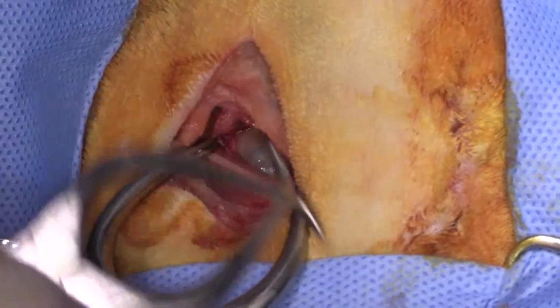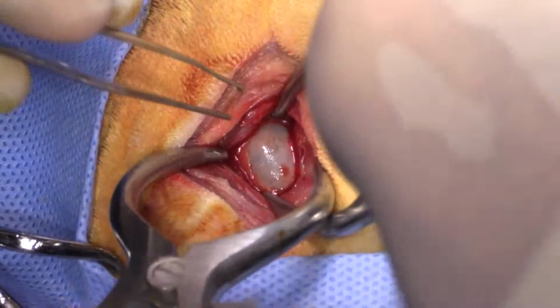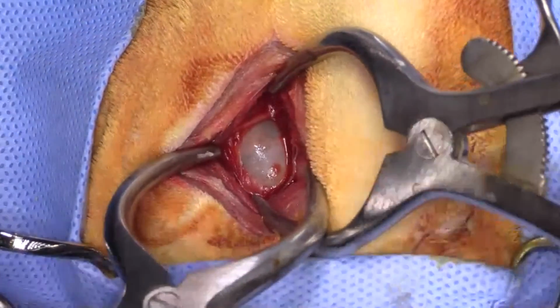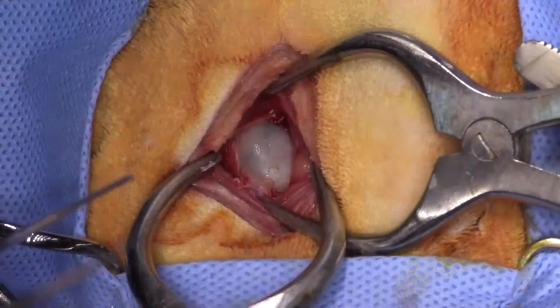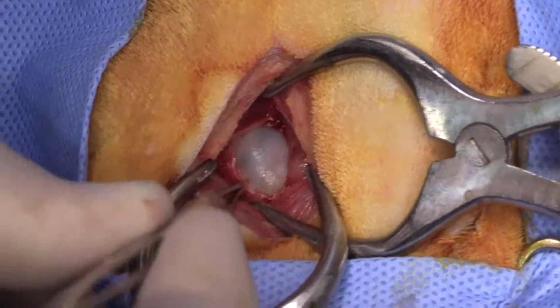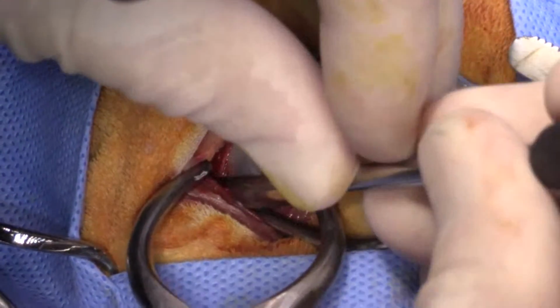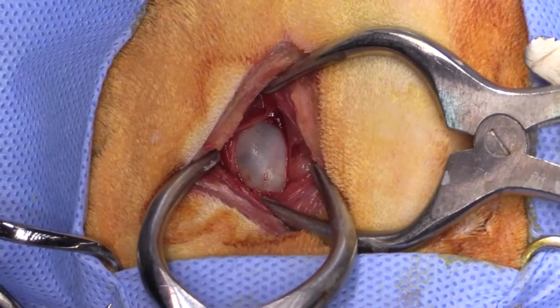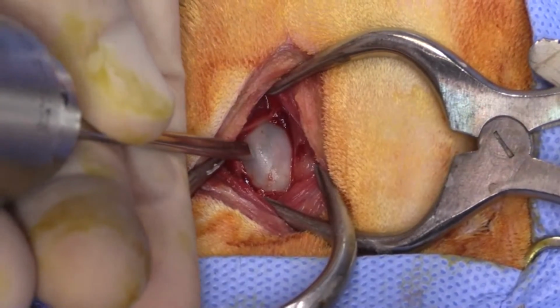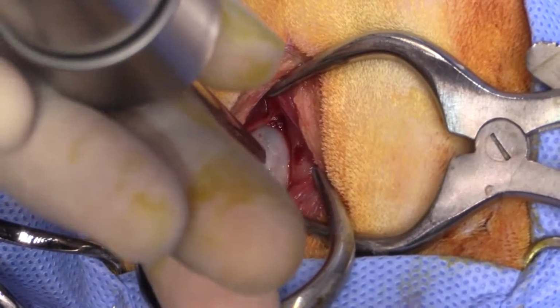I'm going to turn my Gelpies around. Okay. Now you guys should be able to see that bulla really, really clearly. Right there. So that's a really lovely view of that. So just cleaning that off a little bit. Now I'll get my pin. So this is a 1/8 inch pin. And I'm just going to drill, just twirling it with my fingers.